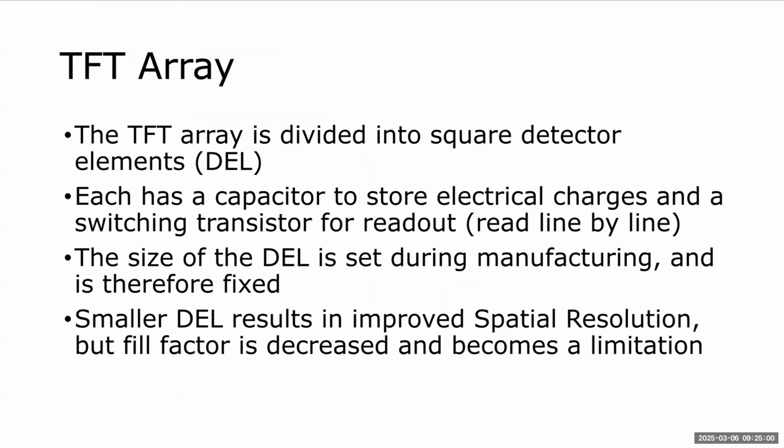The TFT array is divided into square detector elements, so instead of pixels, we have dels. Each has a capacitor to store electrical charges and a switching transistor for readout. With the TFT, it's read line by line. The size of the del is set during manufacturing, so it can't be changed. But just like with smaller pixels, smaller dels result in improved spatial resolution. But fill factor is something to consider.